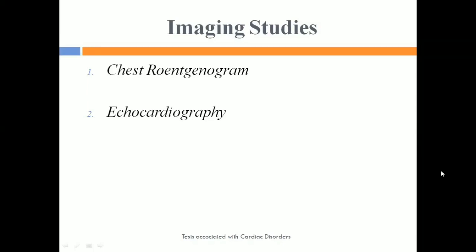With echocardiography, we see the different functional activities and disorders of the heart by sending sound through the heart. Based upon the heart functioning and the resistance of different tissues in the heart, some sound waves reflect back. Based upon the reflection of the sound waves, we get 2D and 3D images of the heart. That's how we perform echocardiography, right?